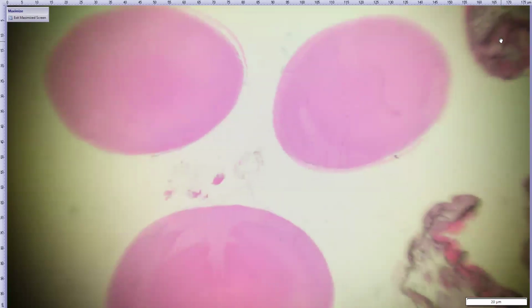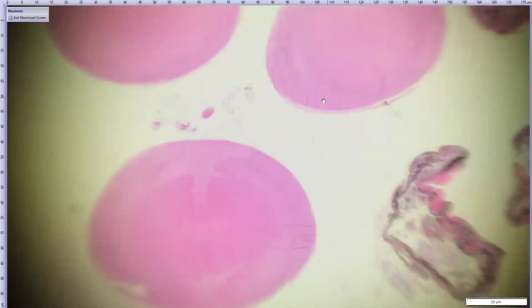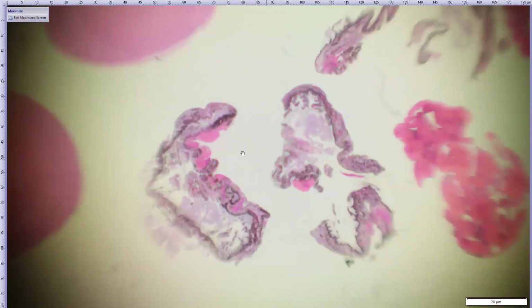So, when we get our evisceration samples, we usually do serial sections just to look at as much of the tissue as we can. So we have a couple of sections of lens. Here we have some pigmented uveal tract tissue. Here we can start to see some of the ciliary body plicae. There's a little bit of surgical hemorrhage, presumably here, and then these little fragments of this light pink tissue are retina, or at least what's left of the retina in this case.